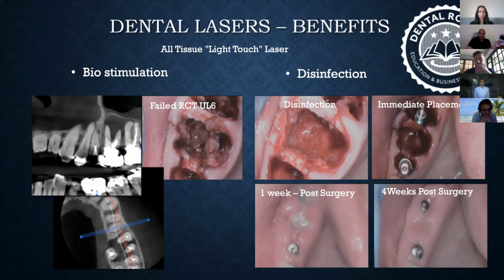Okay. And once I have disinfected everything, because I get so confident about the amount of disinfection I can achieve, I'm able to place the implant at the same time. Okay, and then I've done my augmentation and all of those, which is not of much discussion for today. And look at this. This is healing at 1 week. Okay, and I get amazed every time I see that. And this is nothing to do with me. I am no great surgeon, boss. I'm very simple, but it's the laser that does it.